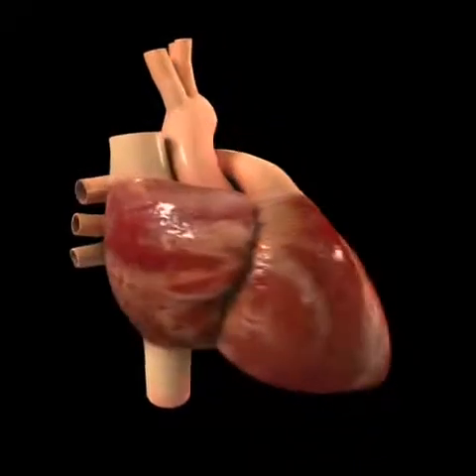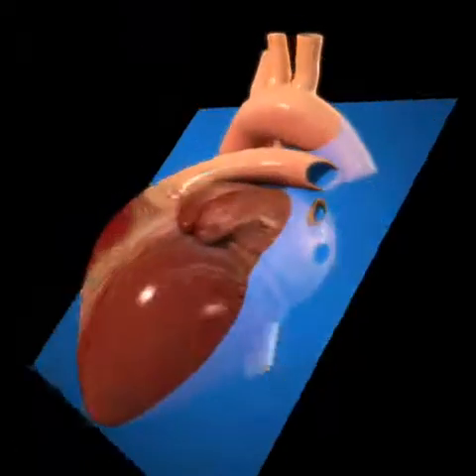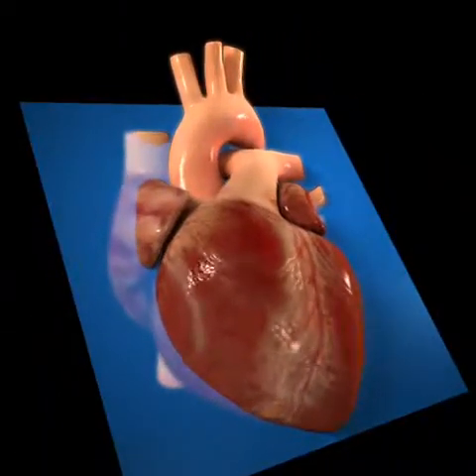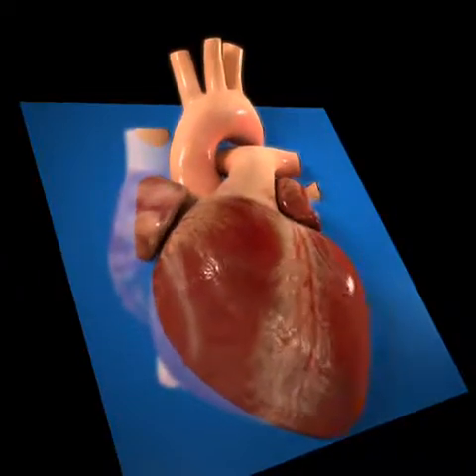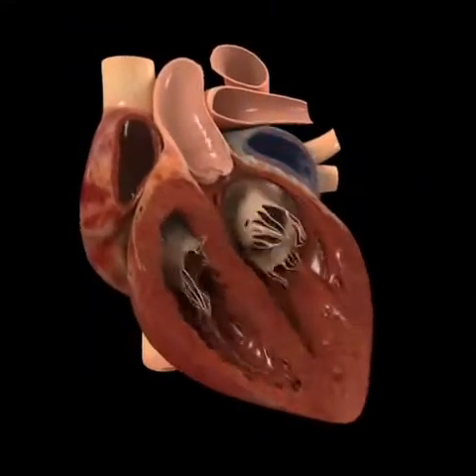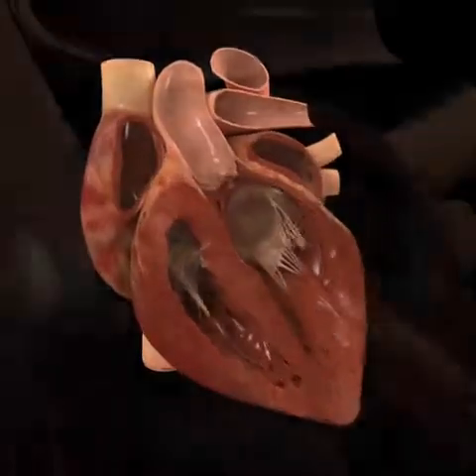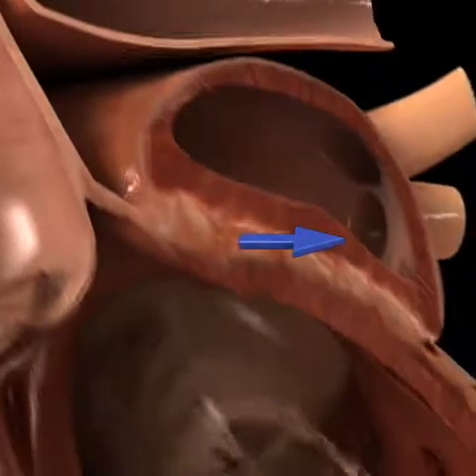The apical view sections the heart from its base to its apex in a right-left view, through the obtuse and acute margins of the left and right ventricles respectively, as well as its corresponding atriums. We can see the left atrium from its upper inferior dimension, as well as the opening of the left superior pulmonary vein and the left inferior pulmonary vein.